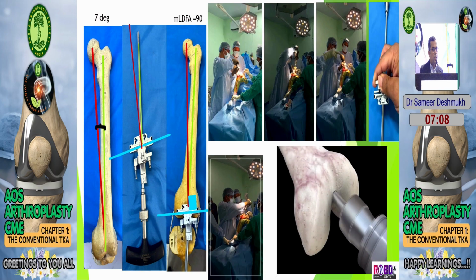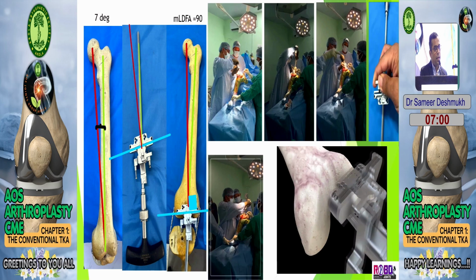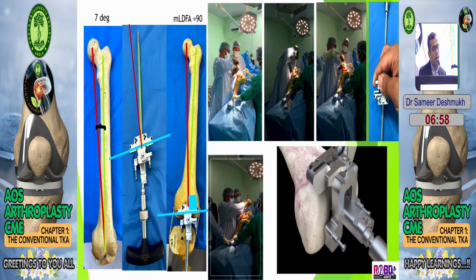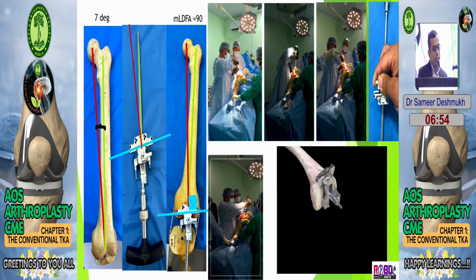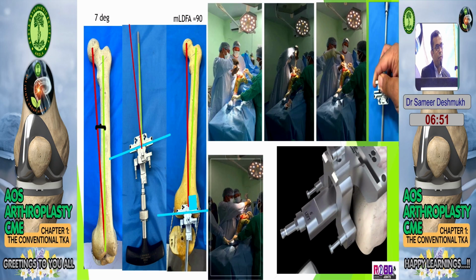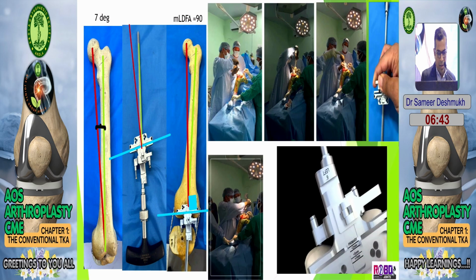So this is the jig which we use for the distal cut. The rod is inside the femoral canal. The red line is the mechanical axis of the femur, and the jig is set at the degree of valgus which we have already calculated over the x-rays. So now the distal cut is perpendicular to the red line, that is the mechanical axis.